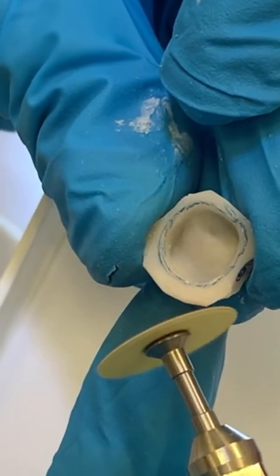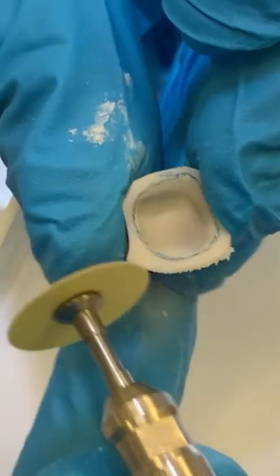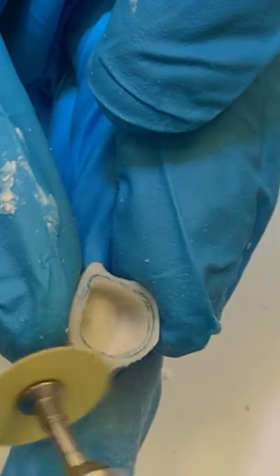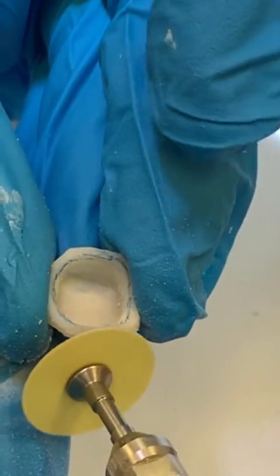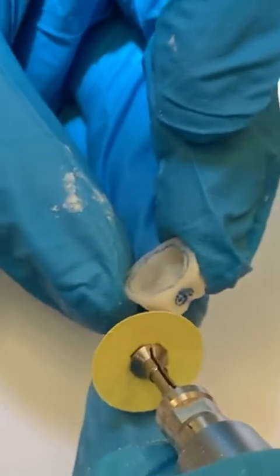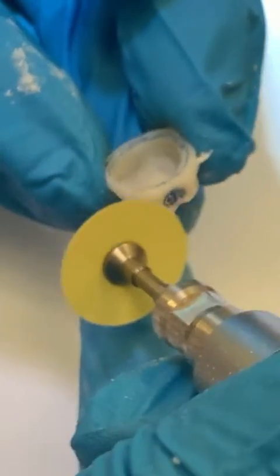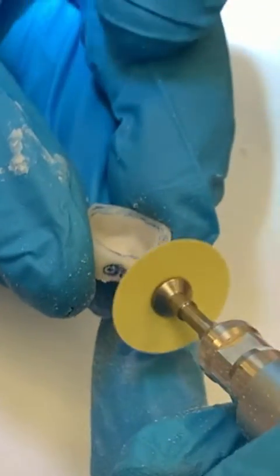We're using the disc — more disc. Go like this and pull. Since you know where the mark is, you're not afraid to cut what you shouldn't be cutting. Basically you do like a 30-degree, 45-degree angle. Remember the mark I put right there — you can touch in proximal, but don't erase the mark. Just keep going like this.